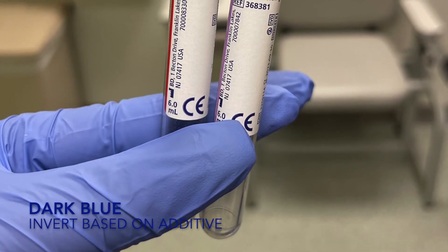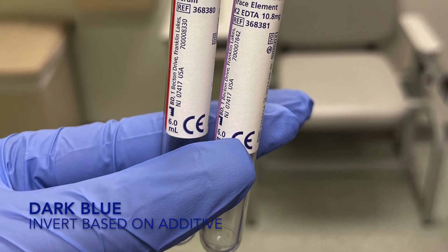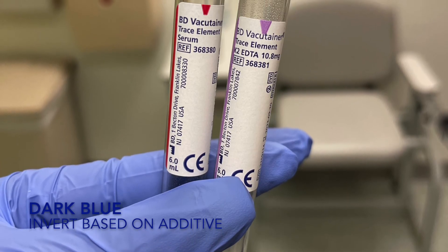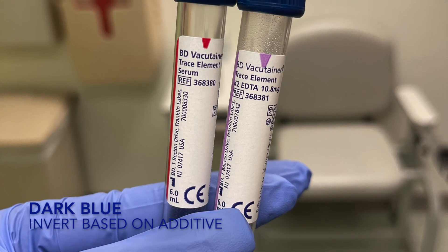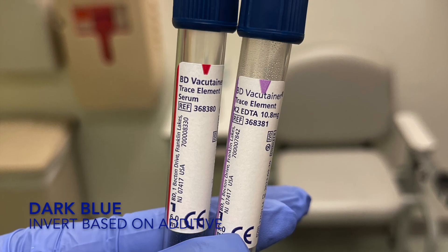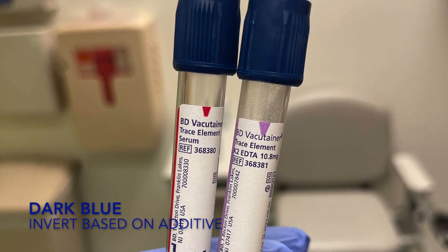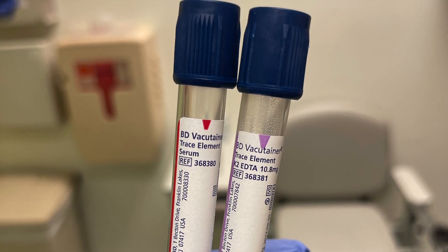These tubes are dark blue, also called royal blue. They are used for trace elements in K2-EDTA whole blood. You draw the sample based on whatever is on the label. For example, since the trace elements tube has a red strip, you would draw it before the red top. For the purple EDTA, you draw it after your CBC. Whatever is on the strip, just draw it with that family group.